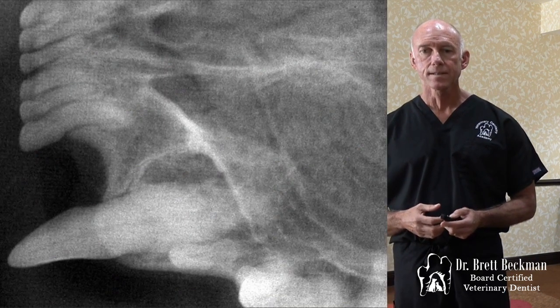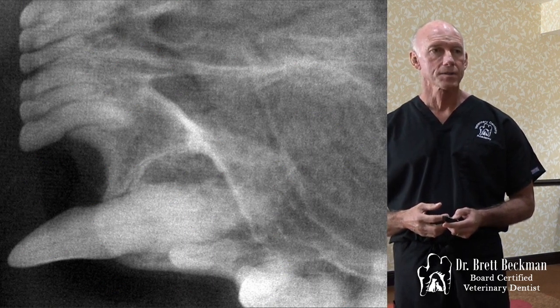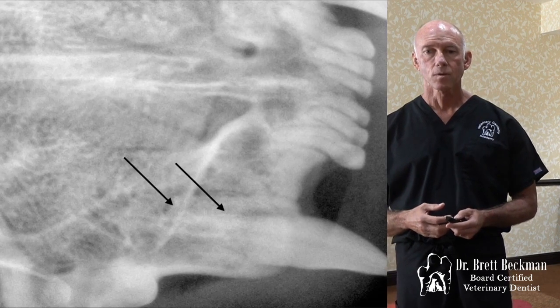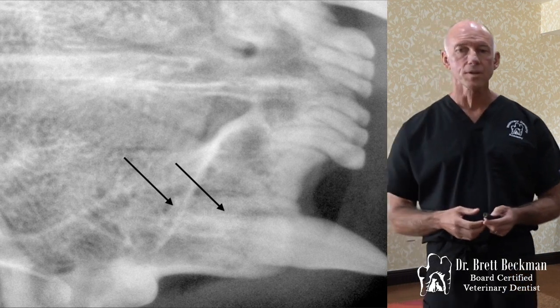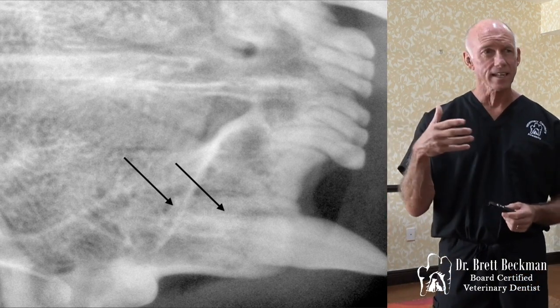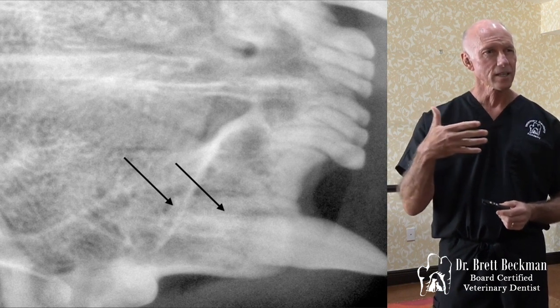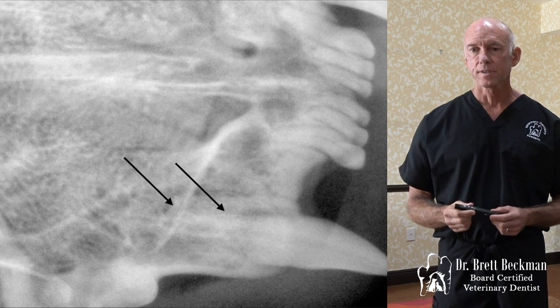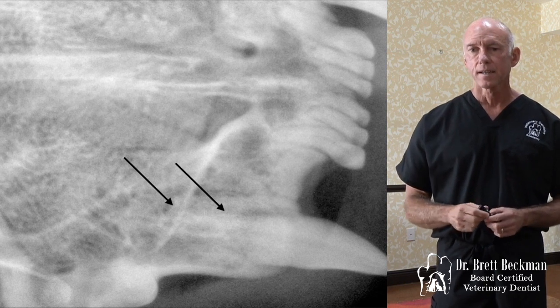So same thing, other side. Doesn't look that bad, but that one's a little bit more pronounced. You see that a little better on that one. Again, there's normal. Another patient, where those arrows are, you've got a lucency. You start to get that striation effect. It kind of looks like wood, like you can imagine splintering wood would look. So you start to get that striation effect.